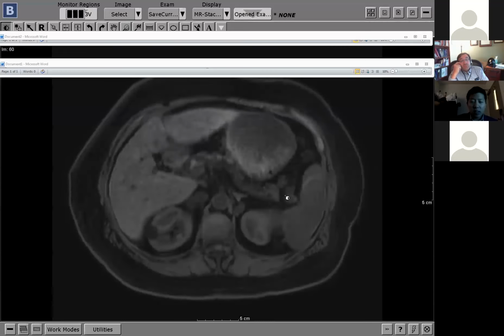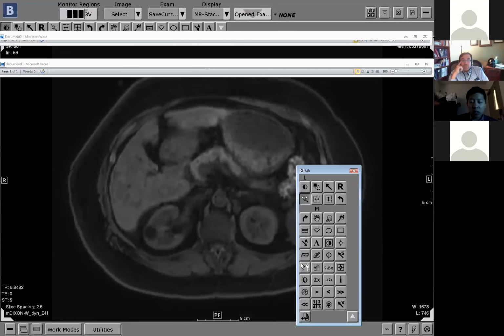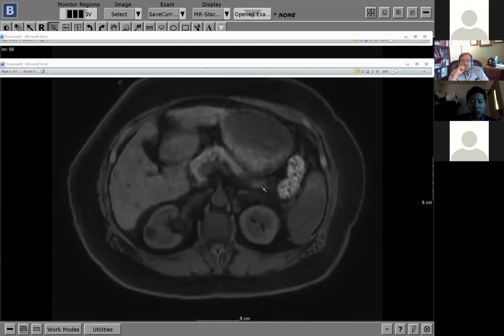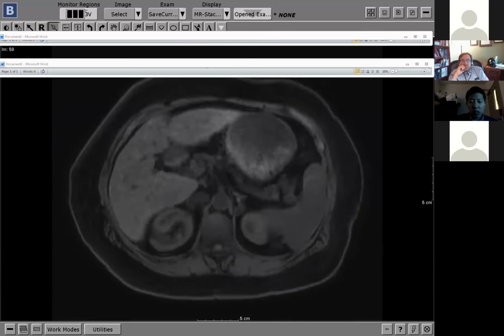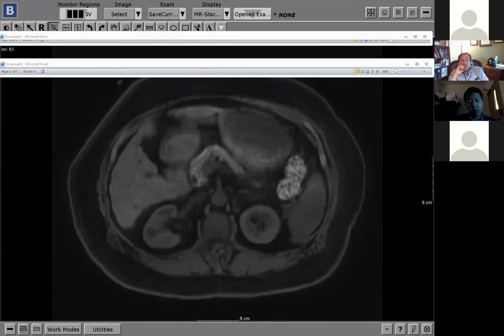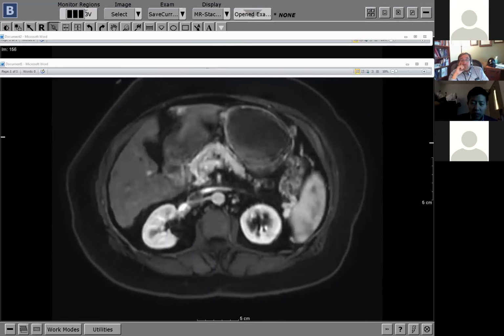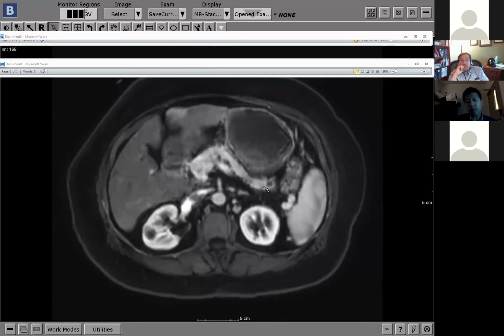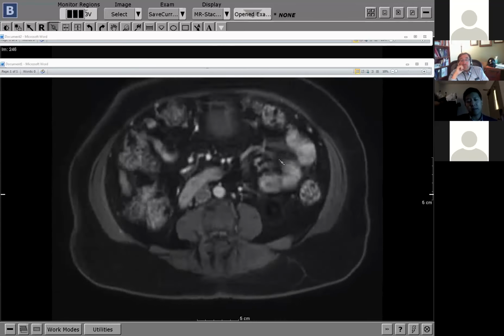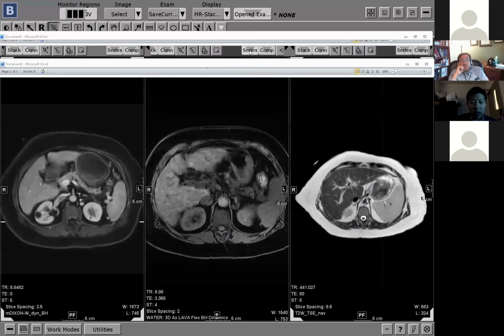But had the question been to evaluate the pancreas, maybe I would have said something is there, and get an EUS. But I don't know. What do you guys think? Is this callable? I don't know. It's hard, once you know. And here's the post contrast. That's really tough, not very impressive. And I'll show you the diffusion.